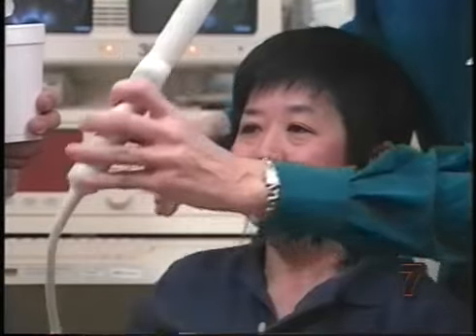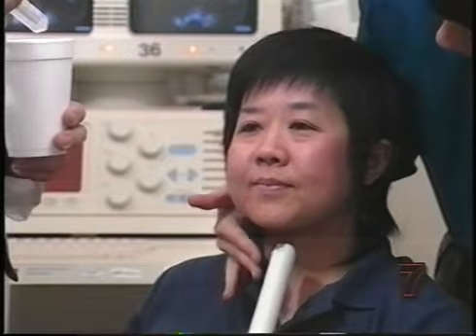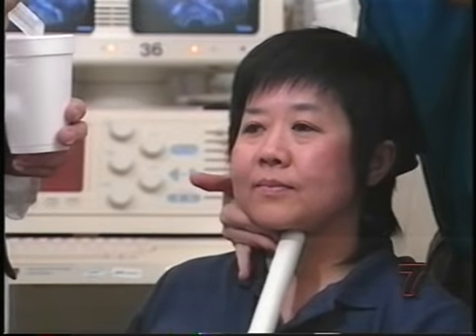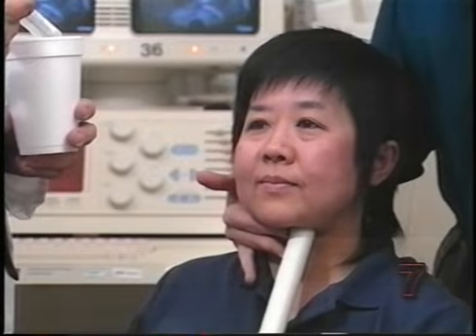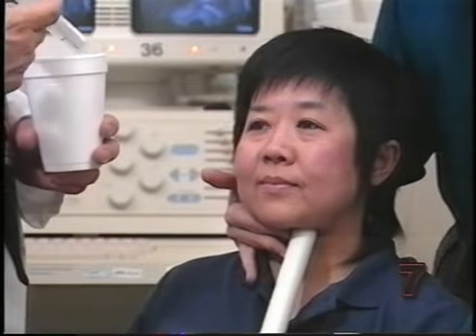We're going to look at your swallowing patterns now on ultrasound. I'll hold the transducer under your chin again, and this time Bob will use the syringe to inject the water. That way we can control the amount of water that goes in your mouth and that you swallow.